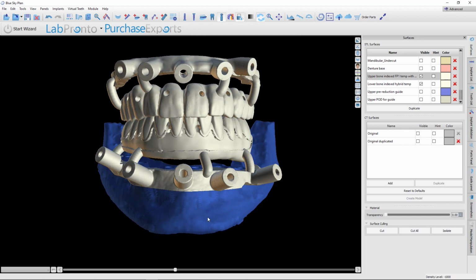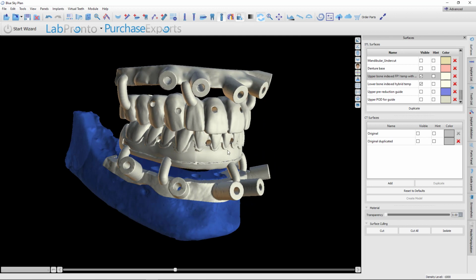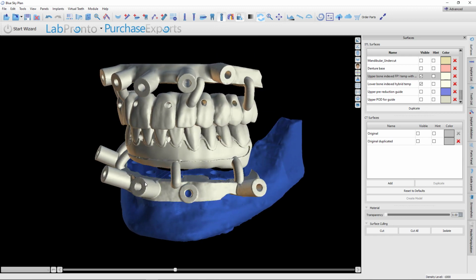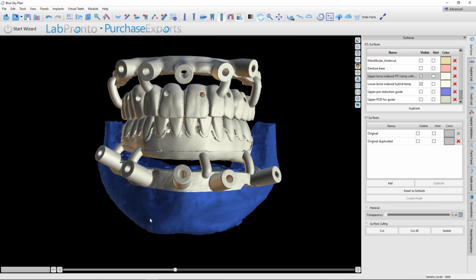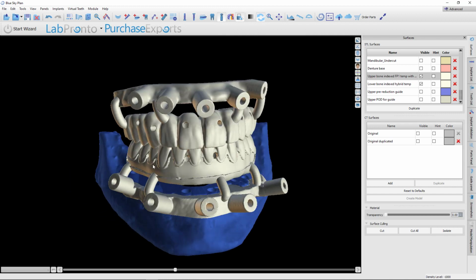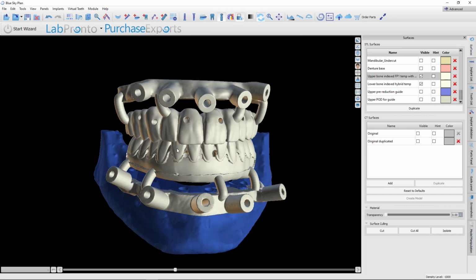It's worked extremely well. Yeah, you can do stackable. If you can do this, stackable is not a problem either. I typically just don't teach stackable because there's a lot of litigation surrounding that. And frankly, this works in my hands just as well. Maybe it takes another 30 seconds to a minute to swap these guides out throughout surgery. But my gosh, if you can design all this yourself, you're probably looking at $100 an arch all-in cost compared to a lot of the guided products on the market that can be upwards of $7,000, $8,000. So this is a really cool workflow.